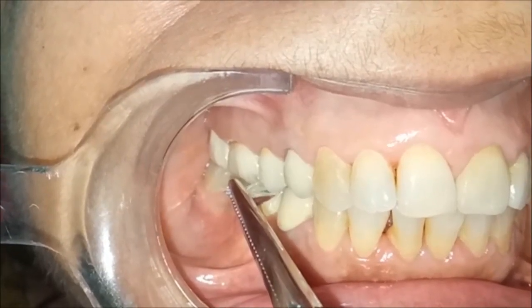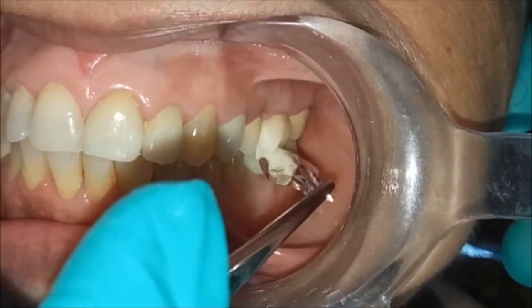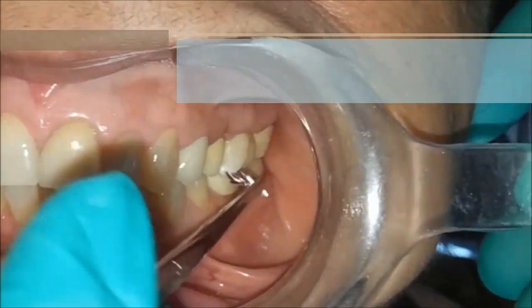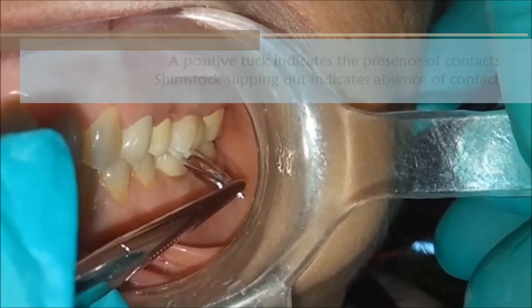Each time you are doing this, it is always a good idea to go ahead and check the other side. Close the bite down. We are getting a catch here, which means we have a positive stop even on the other side.